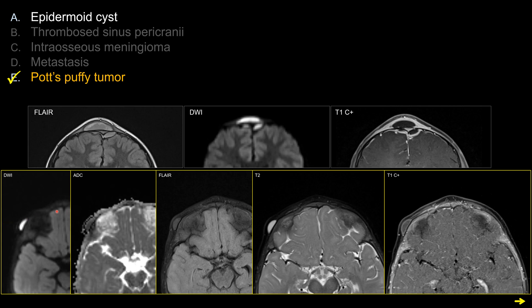For choice A, epidermoid cyst: a classic epidermoid cyst is bright on T2 like a cyst, but on FLAIR it does not suppress like pure CSF — it looks a bit dirty on FLAIR. It has bright signal on DWI and relatively dark signal on ADC, indicating some degree of reduced diffusion. An epidermoid cyst should have at most rim enhancement and should never have internal enhancing soft tissue. It does not cause surrounding inflammation or phlegmon like in our case, and certainly will not cause intracranial extension or intracranial infection. The caveat is that an epidermoid cyst can get infected and produce abscess, but overall choice A is not the best answer.